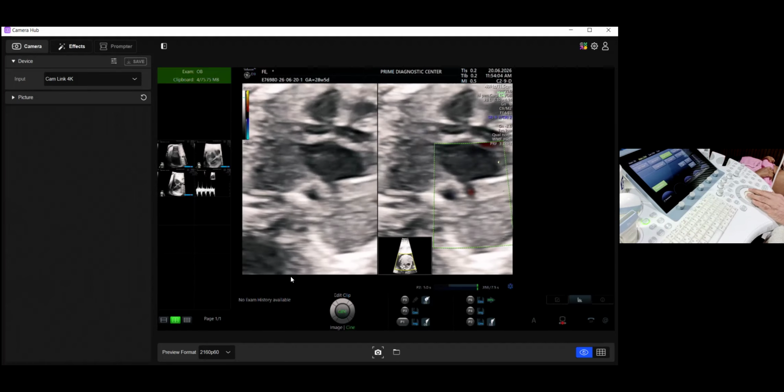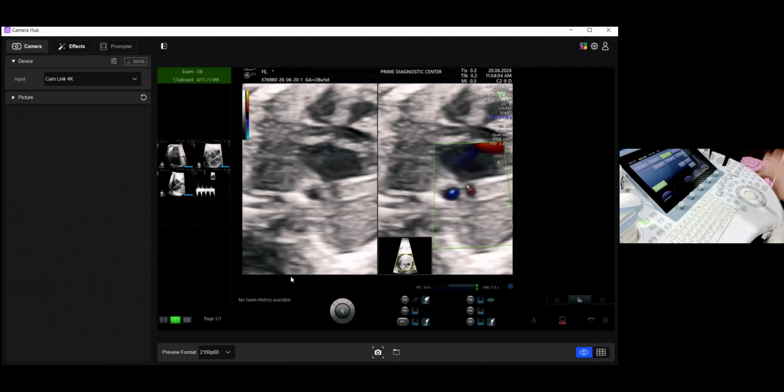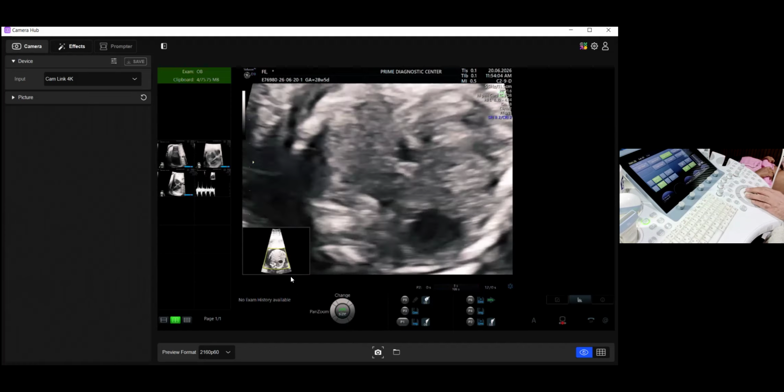That is the aorta, and the distance from here till here is smaller than the size of an aorta, so this distance is normal. It is not increased. I use visual judgment. If I am able to place another aorta here behind the heart, I would say this is increased.